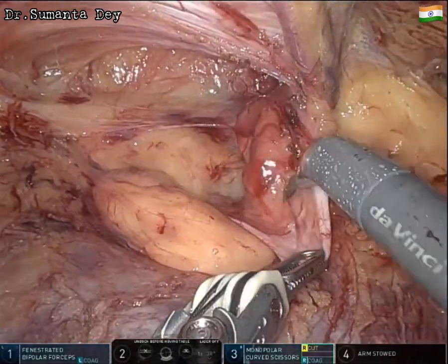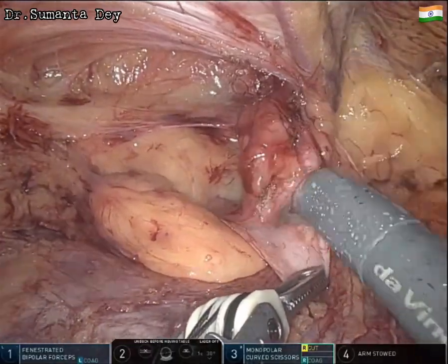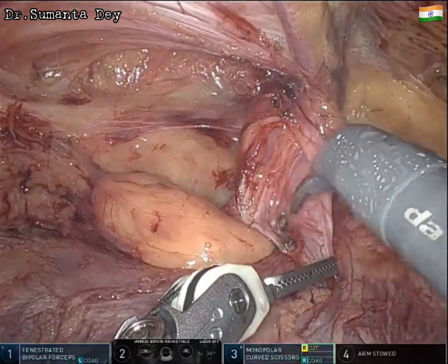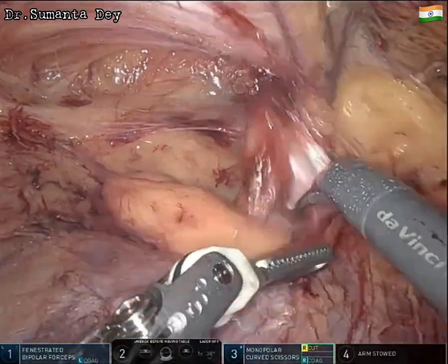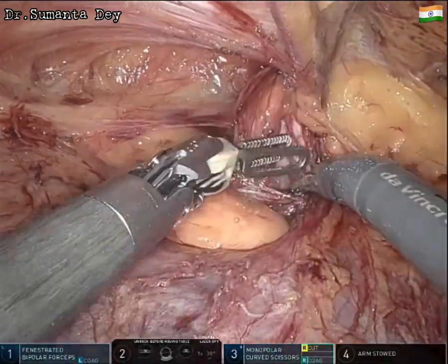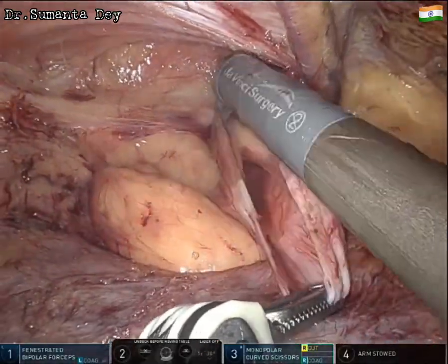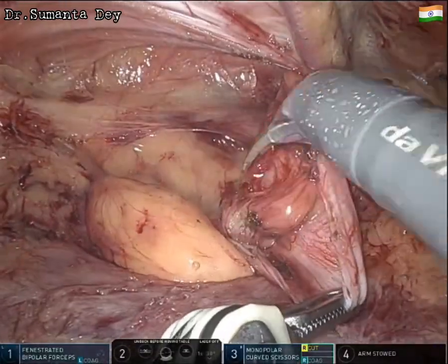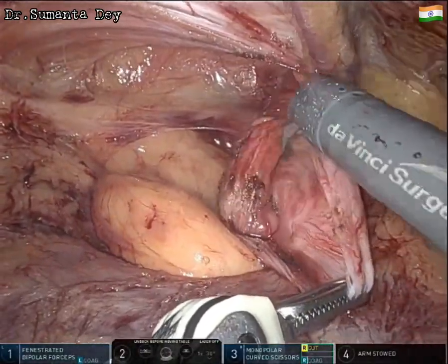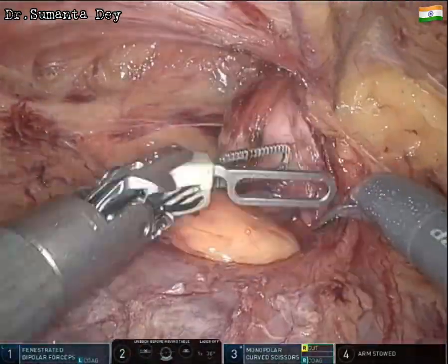The gonadal vessels and cord structures are separated from the sac. With the left hand pulling the sac, the gonadal vessels are pushed away while staying close to the hernial sac. A little monopolar energy is applied to cauterize smaller blood vessels, but mostly sharp and blunt dissection is used.